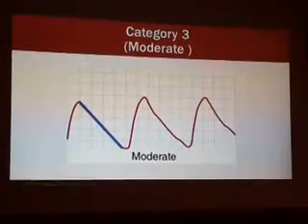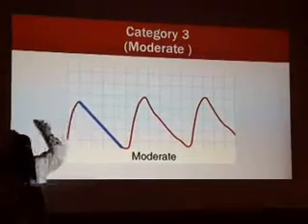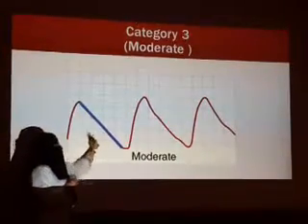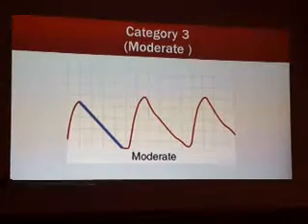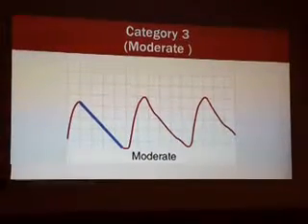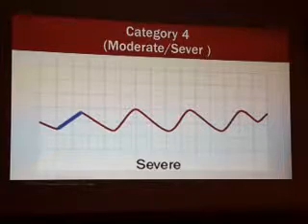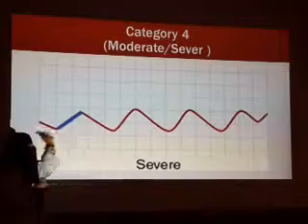Category 3, again: now the systolic becomes a little bit rounded, and the notch has already disappeared. And the diastolic slope almost slopes away from the baseline. So this is moderate. It could have mild stenosis, up to 40 or 50%, at this area, at the distal leg maybe. You'll see this abnormality.